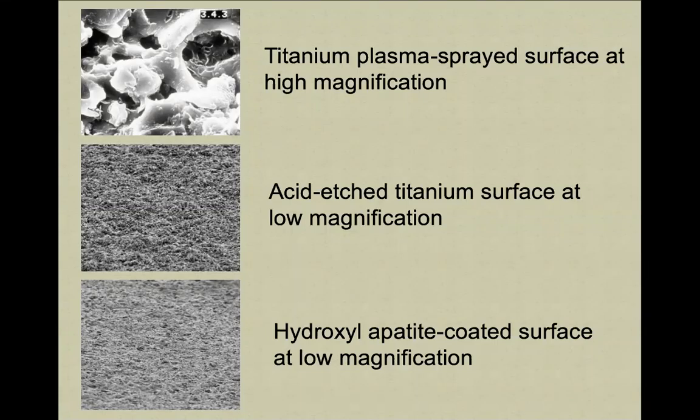In maxillofacial surgery, we use titanium mini plates and screws for osteosynthesis, when we're managing jaw fractures, or we can use reconstruction plates and screws for the management of defects of the mandible.